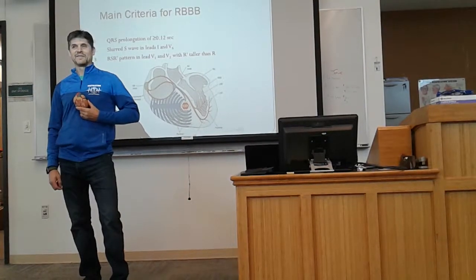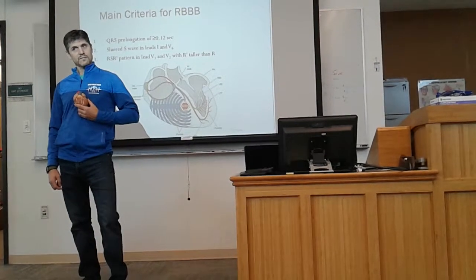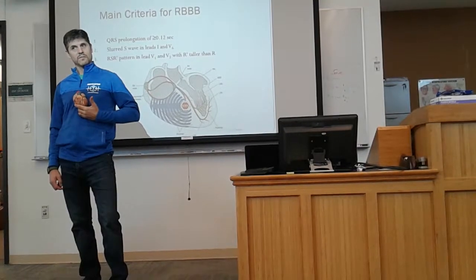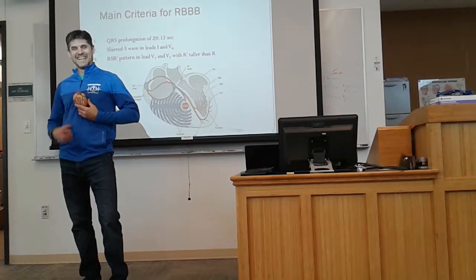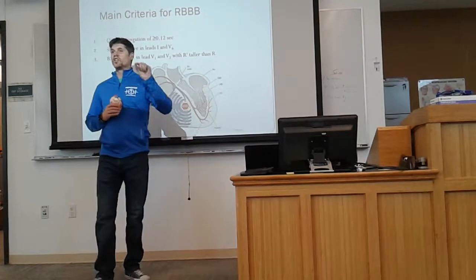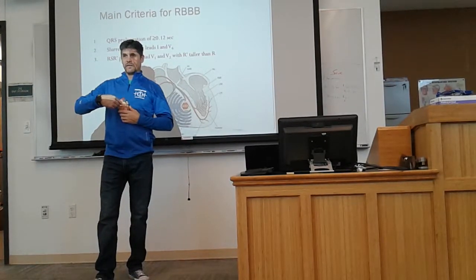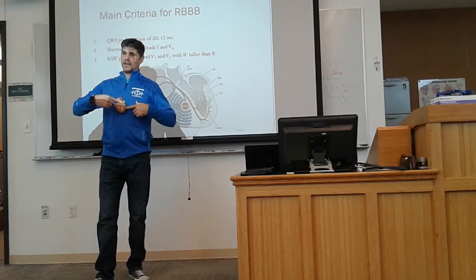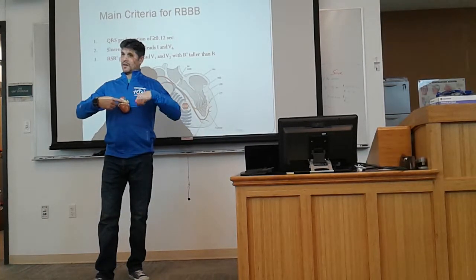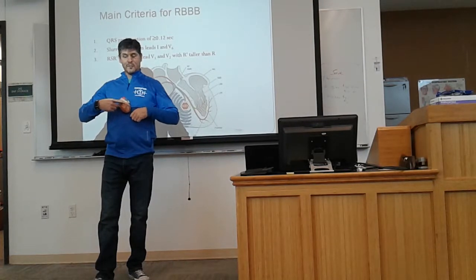So can you tell me about the R prime, which one's stronger, taller? The R prime will be the largest of the two, because it's right here. And the left side, to V1, will either be negative, because the electricity is traveling away, or biphasic.